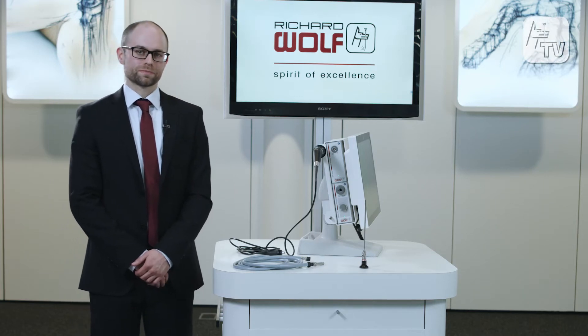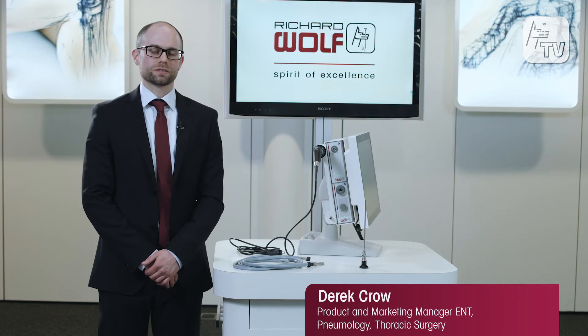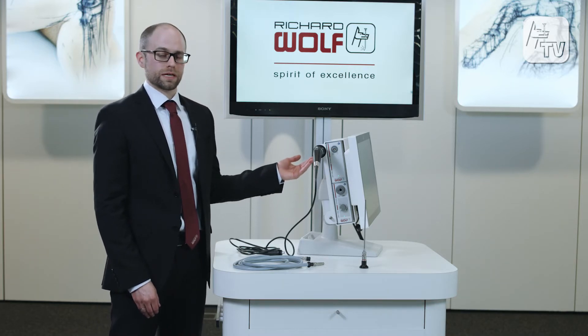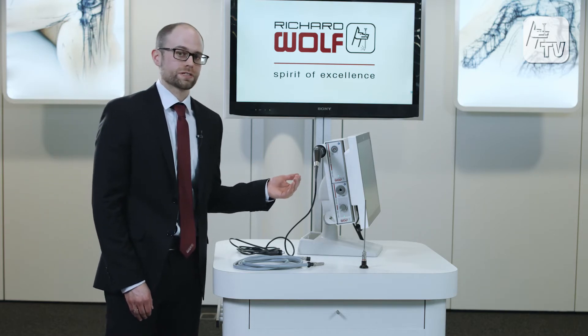Today I'd like to introduce the latest innovative camera system, EndoCam Flex HD from Richard Wolf. We have here a compact HD endoscopic video system, perfect for the ENT office or ambulatory setting.